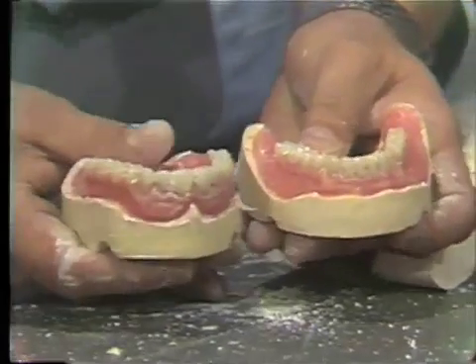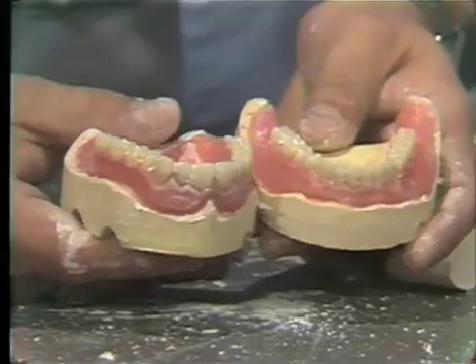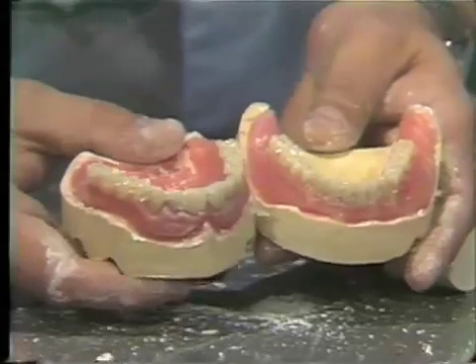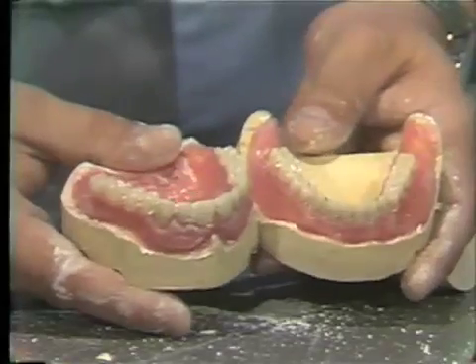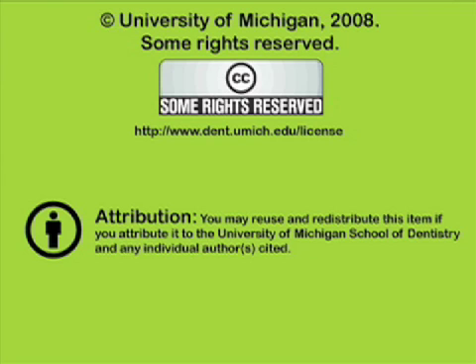So I think you've seen here a relatively messy procedure, but a necessary one, to remove the dentures from the processing flasks. This is a simple procedure, but an important one, because if you were to be too aggressive, you might break the denture. Now we will go on to finishing the denture in our next demonstration. Thank you.